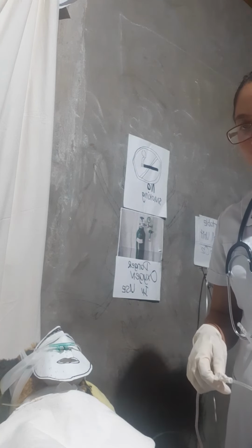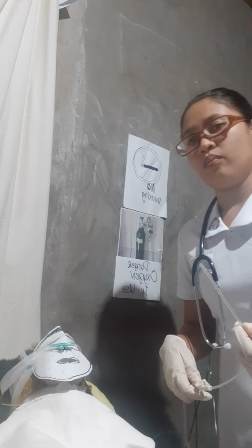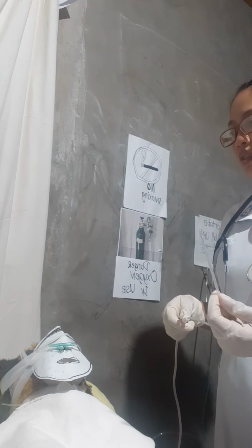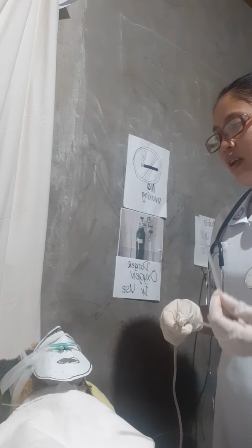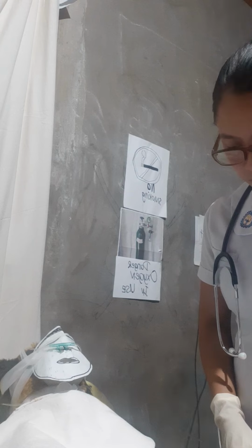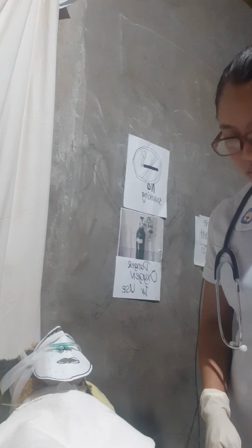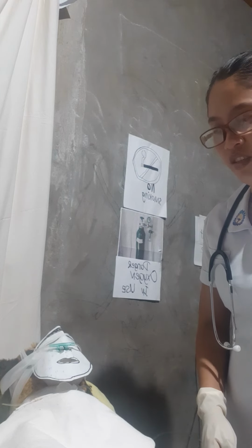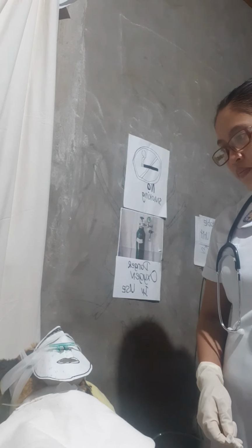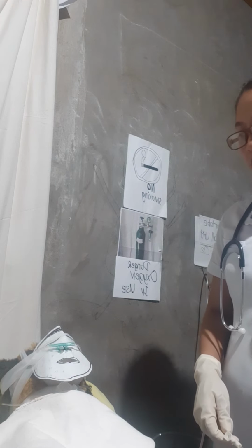Afterwards, if it is working, before we apply it, we need to encourage the patient to take a deep breath. Then apply the lubricant onto the sterile catheter, about 2 to 3 inches, and place it in the sterile field.